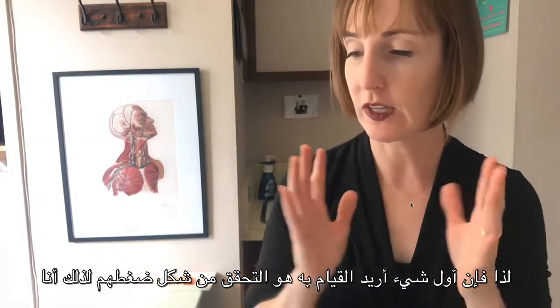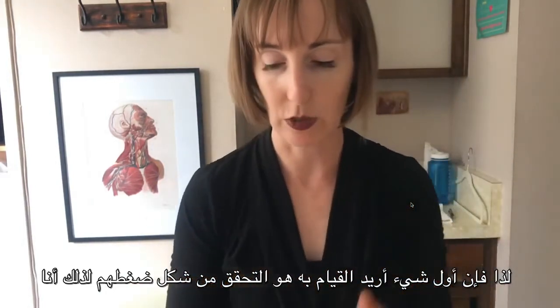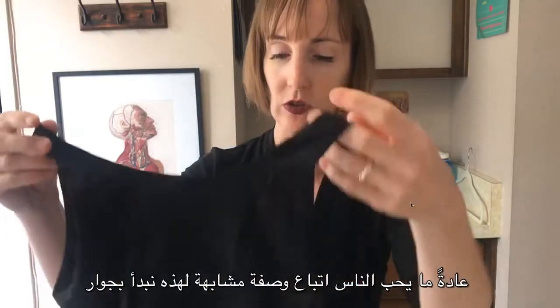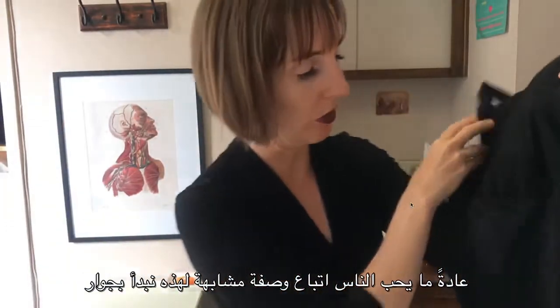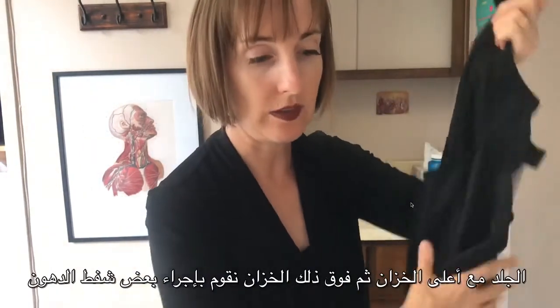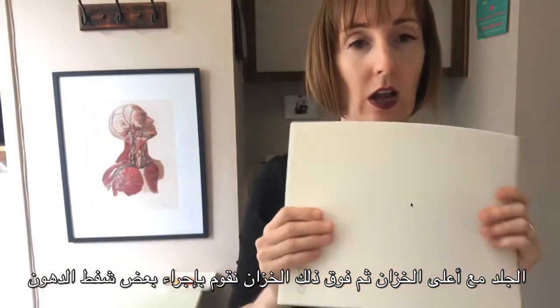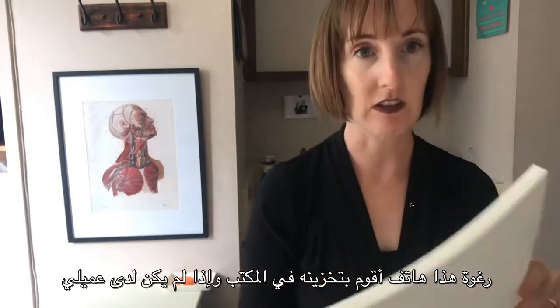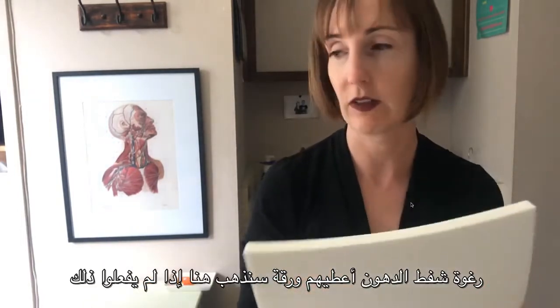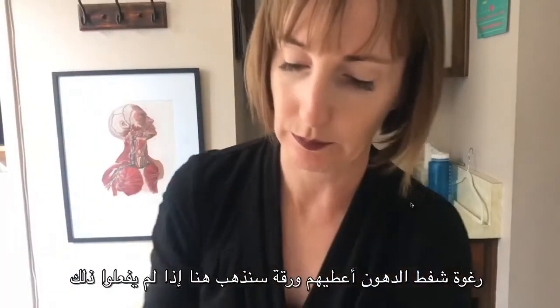The first thing I want to do is check out what their compression is like. I usually like people to follow a recipe similar to this. We start out next to the skin with a tank top, and then on top of that tank top we put some liposuction foam. This is the foam that I stock in the office, and if my client does not have liposuction foam, I give them a sheet.